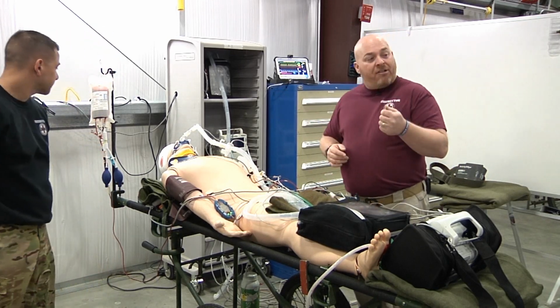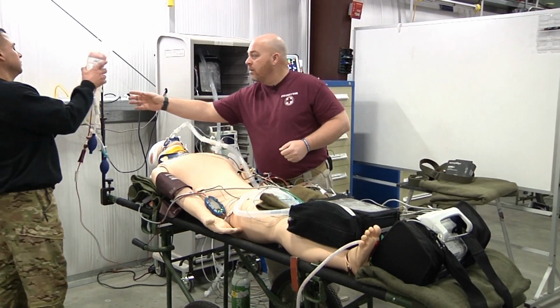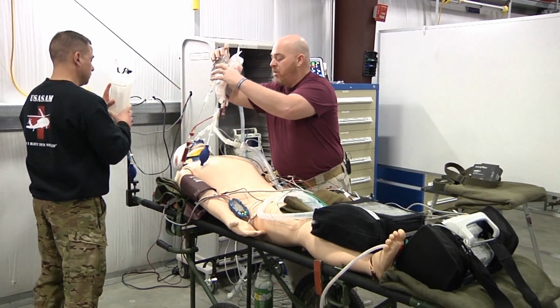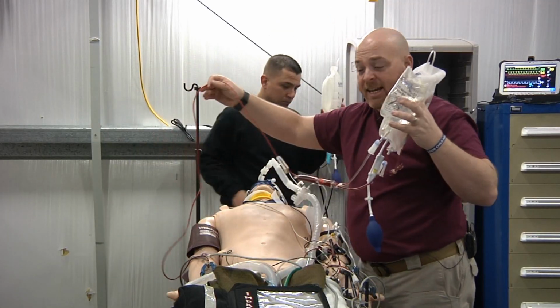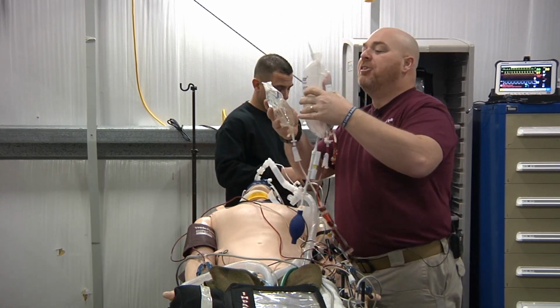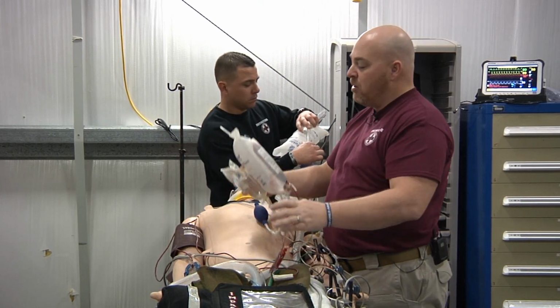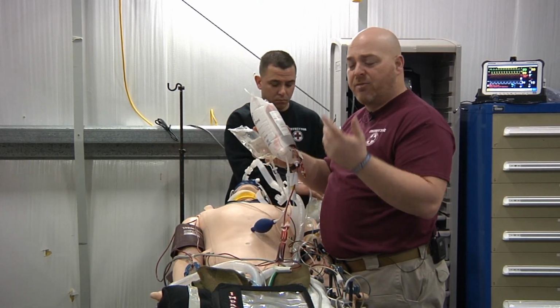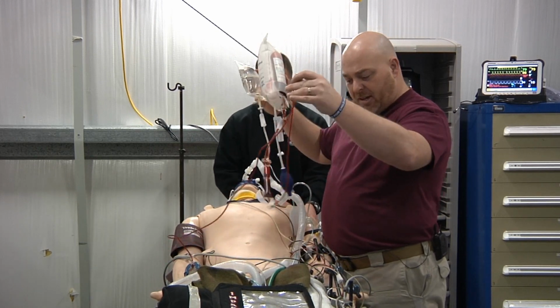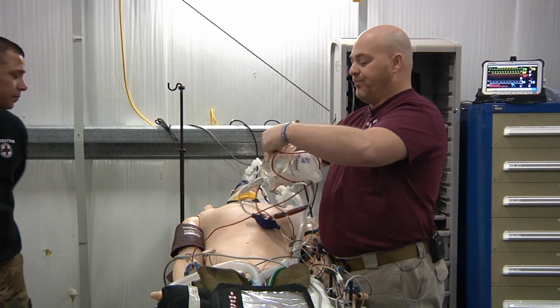We're going to make sure that all the air is out of the bags, and then we're going to take them and put them at the position where they're located. This is one of my favorite techniques because most commonly what I've seen, especially with students coming through the schoolhouse or some other providers, is they just take the bags and they just put them on the chest like this. Right? Well, they're on pressure, they're going to run. That's correct. If they're on pressure, they will run. But a lot of times, as soon as you look at all these cables, you throw them on there, they get all tangled. So what I like to do is make sure the pressure's on.